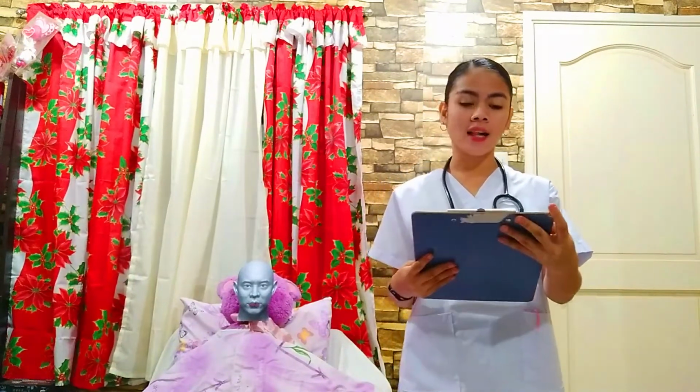Good day, everyone. I'm Ian Grace Mayorga from Cavite State University Main Campus, and I'm going to show you the implementation of the procedure of the Oropharyngeal and Nasopharyngeal suctioning as my return demonstration.